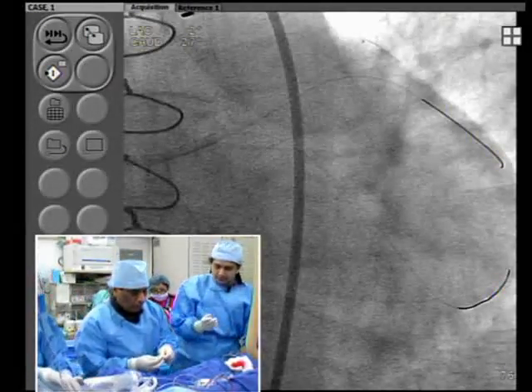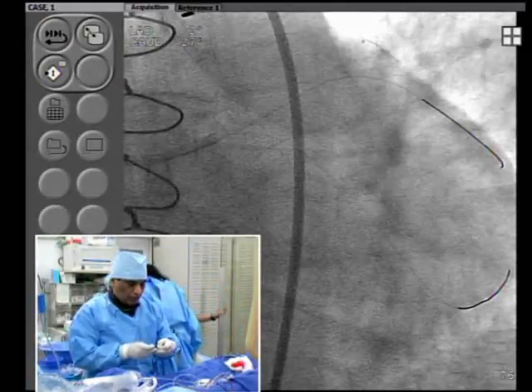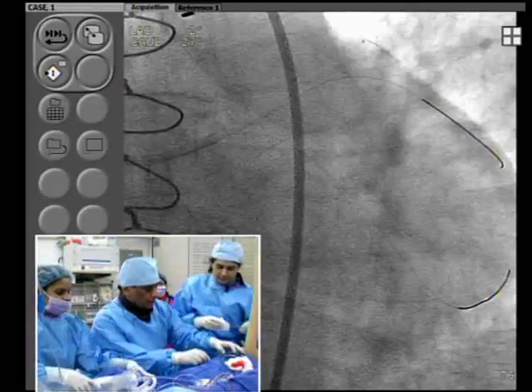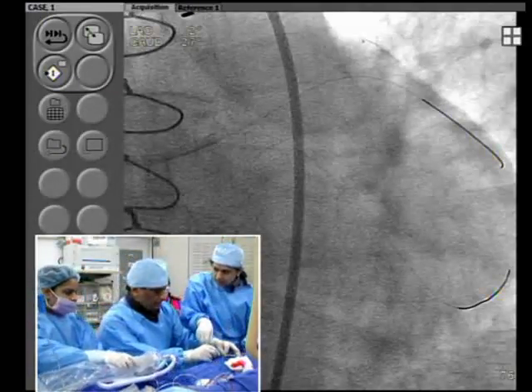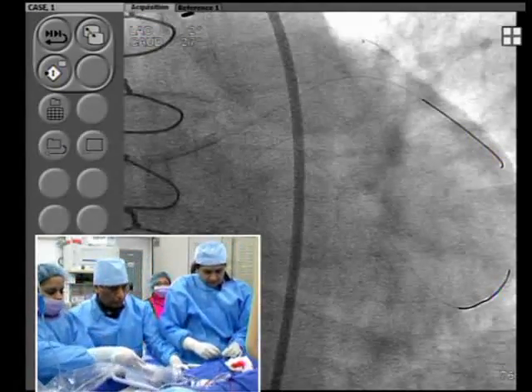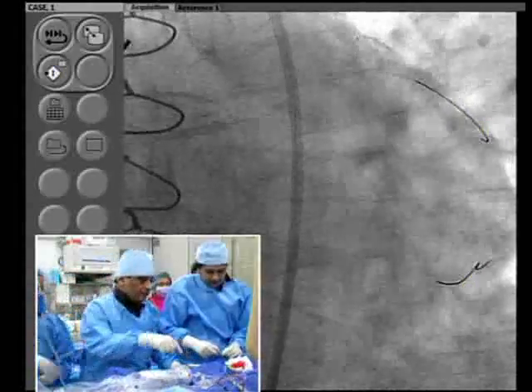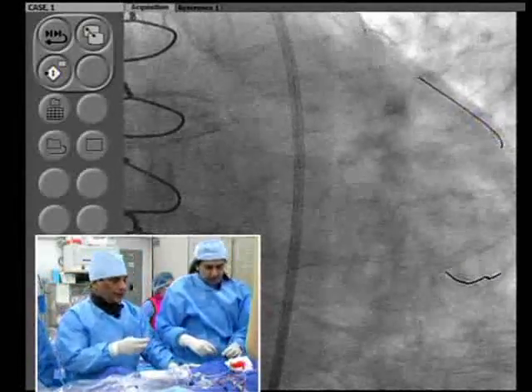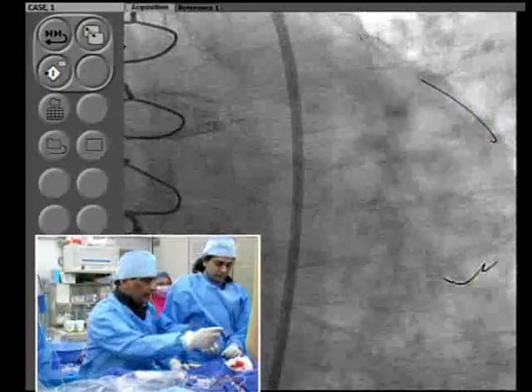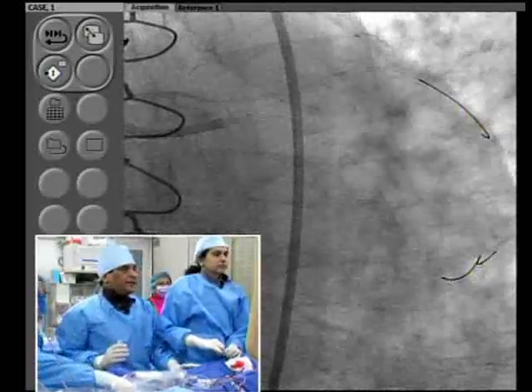Yep. The pre-dilatation balloon always has to be shorter than your stent length. As long as we keep that in mind, we use either the Voyager or the Maverick 2. The post-dilatation balloons are either the NC Voyager or a Quantum Maverick of various sizes, right from 6 millimeter to 20. I favor 20 because the majority of my stents are 20-plus millimeters in length.